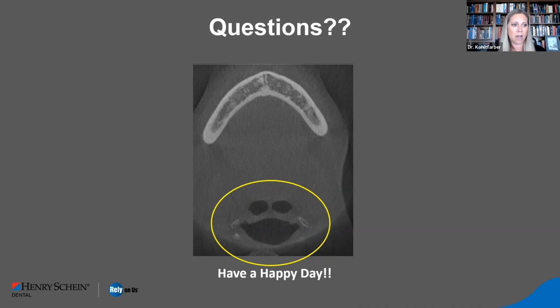Do we see people stopping midstream to take a CBCT to make sure that they're where they want to be? Yeah, we do. Is that ideal?